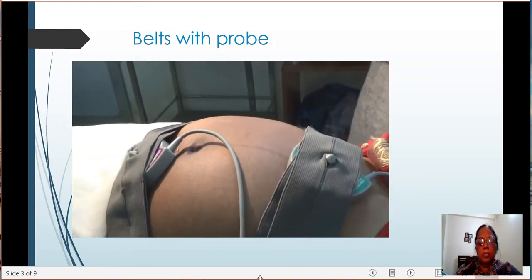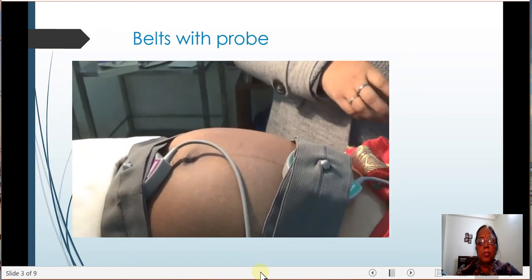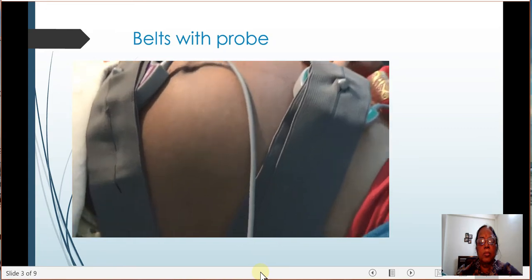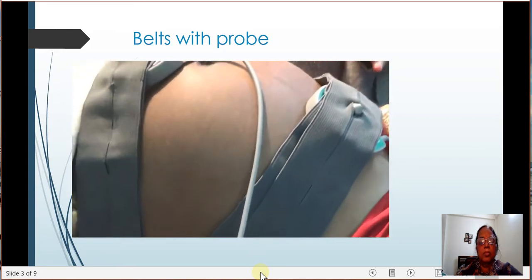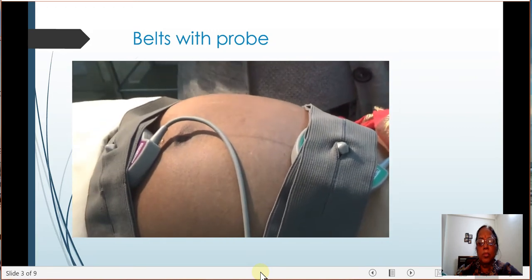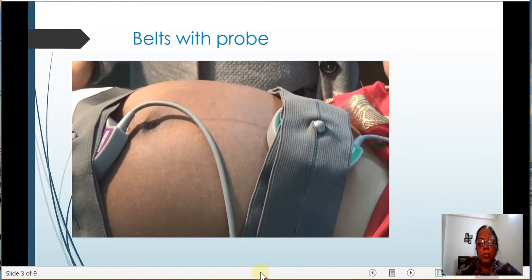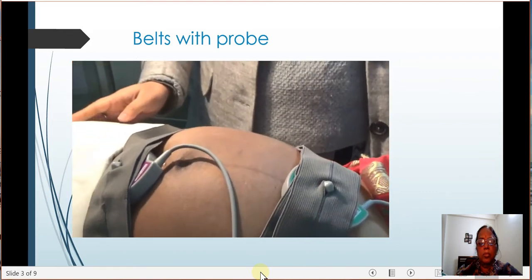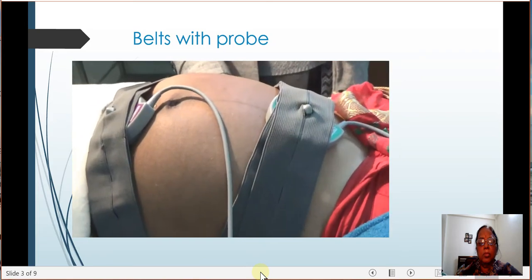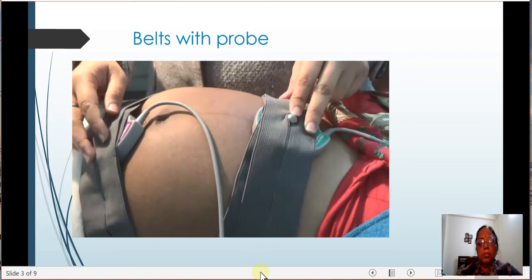Now we are going to start with doing the NST of the patient. For doing that, we have to attach the probes. As you can see, we have already attached the probes in the two parts over here. Before attaching the probe to the patient, we have to make sure that the patient has had an adequate meal, and the second thing, the patient should be positioned in the supine position with a 15 degrees lateral tilt. For this, we have used a support near the buttocks of the patient. Now we have attached the two probes you can see over here.